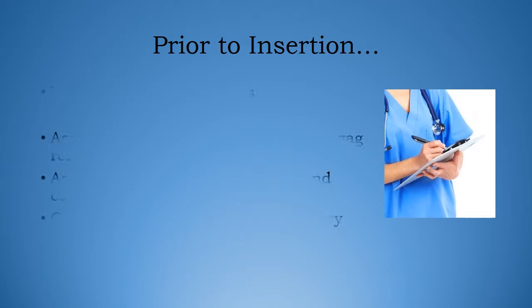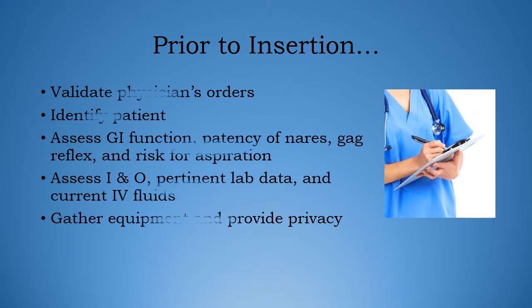Prior to insertion, validate physician's orders, identify patient by using name band and having patient state name and date of birth, assess GI function, patency of nares, gag reflex, and risk for aspiration, assess I&O, lab data, and current IV fluids, and gather equipment and provide privacy.